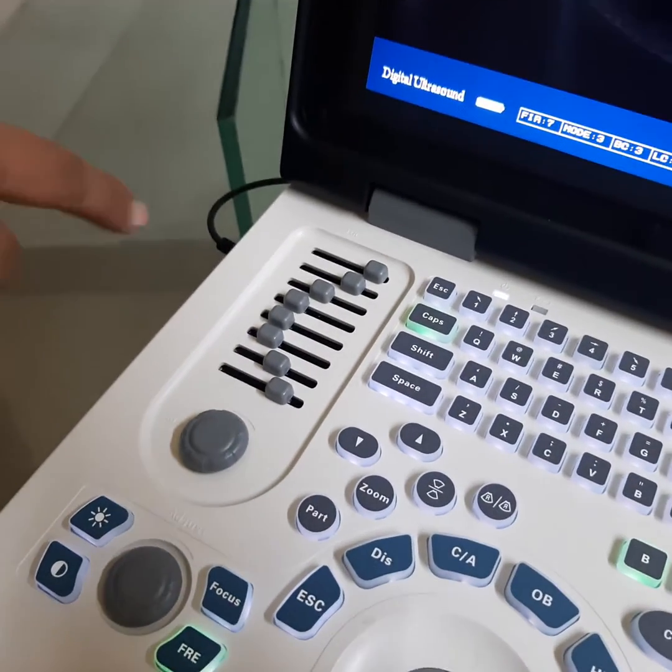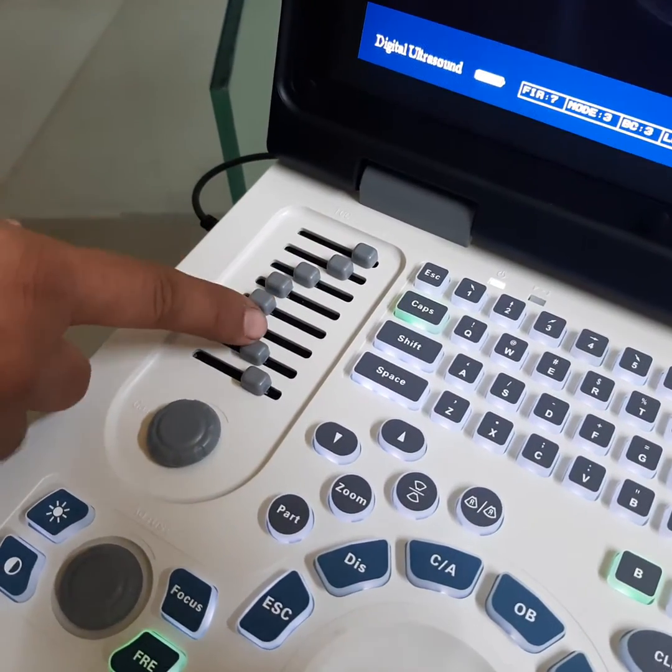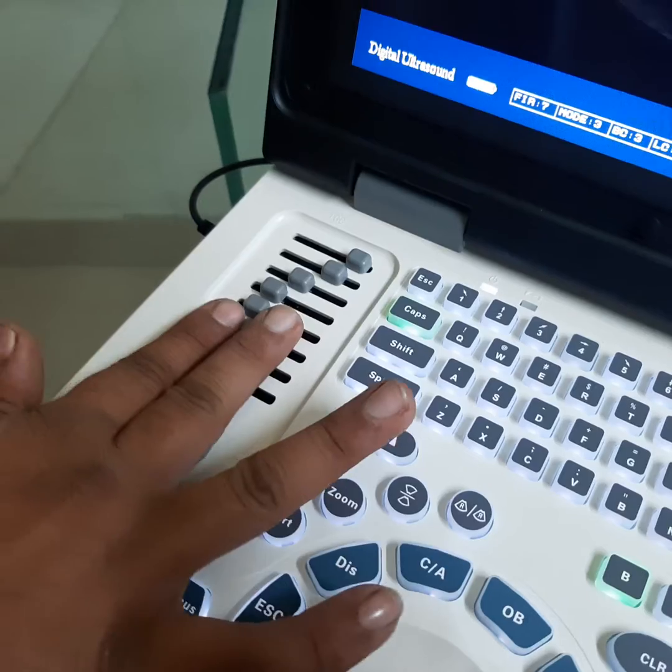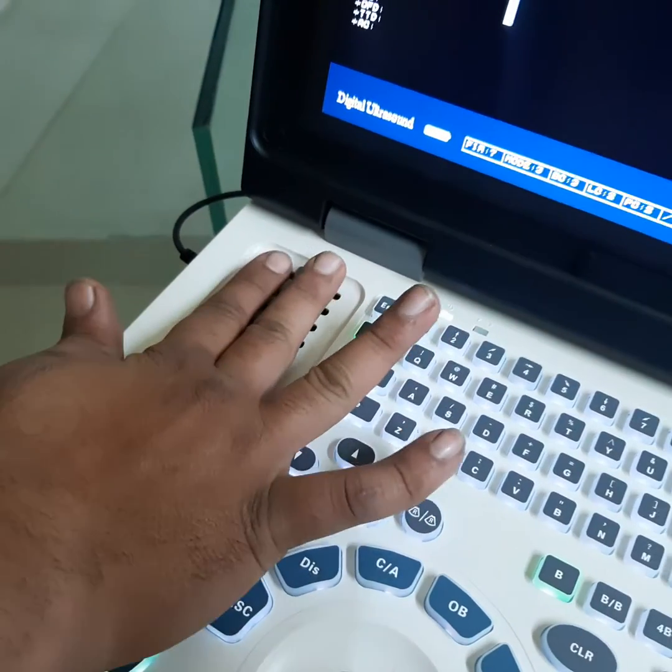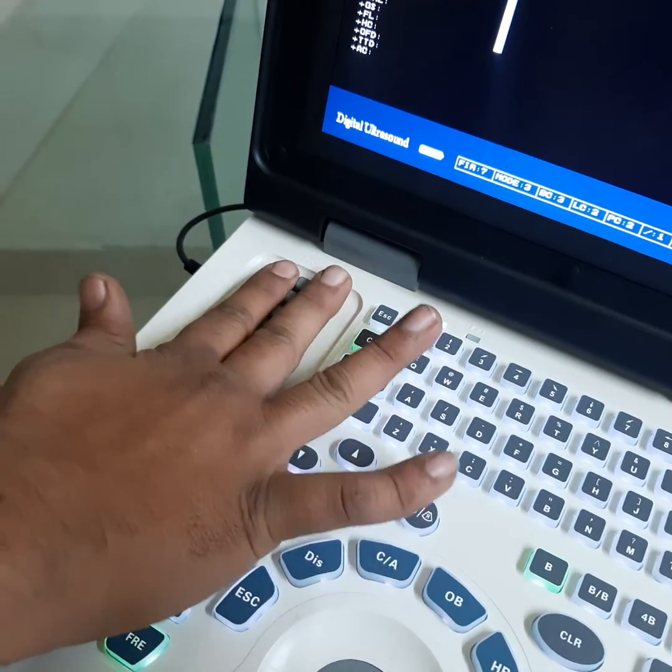First of all, adjust these all eight-step TGCs in the middle, in line in the middle.